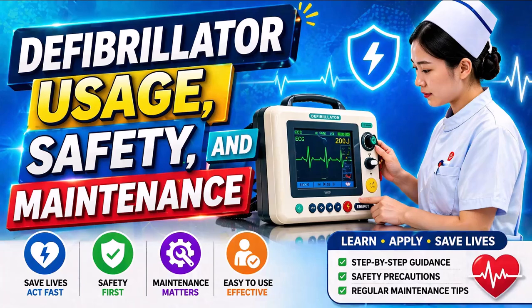Defibrillators consist of several key components, including a power supply, charging circuit, capacitor, control system, electrodes or paddles, and a display unit. The capacitor stores electrical energy and releases it rapidly during defibrillation. Modern defibrillators allow users to select energy levels depending on clinical guidelines and patient conditions.